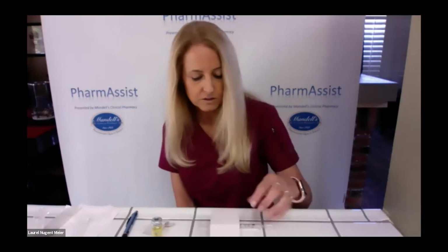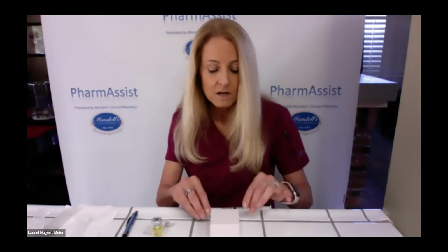Also, if you're giving your shot yourself, I would use the standing technique. You've got the counter for stability, and you can use your dominant hand to give it in the dominant side. Just to get started, you'll definitely want to do that. All right, so let's get started with the actual injection.